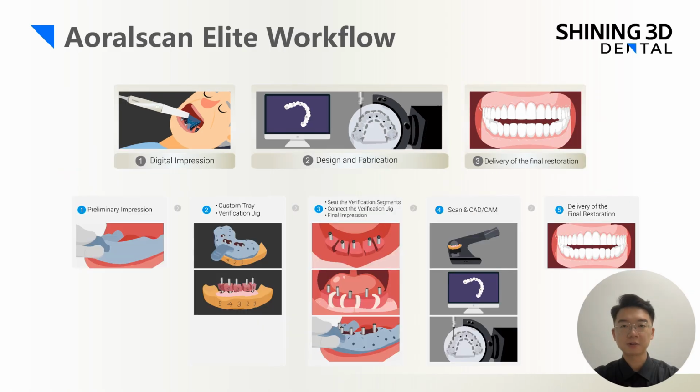Many steps that clinics relied on in the past, such as impressions, verification checks, and try-ins, can now be entirely eliminated. One of our main goals is to help clinics reduce the number of clinical appointments needed to complete a full arch implant restoration for their patients. With the Aoralscan Elite workflow, this is now their new reality. The clinic has been able to reduce treatment from 7 appointments to just 2 or 3, making it easier to be accepted by the patient to do the full arch fixed implantation treatment.